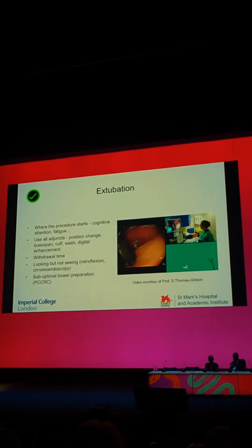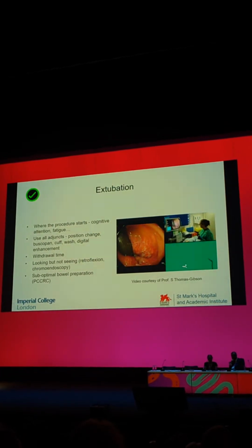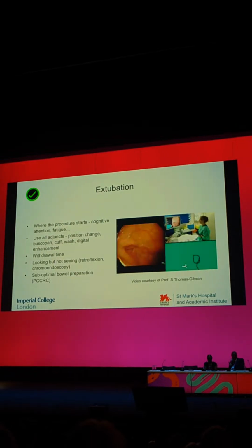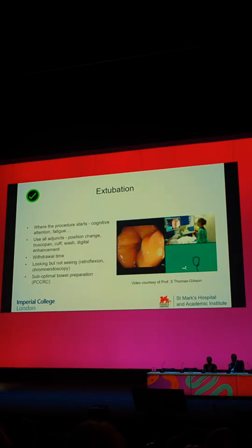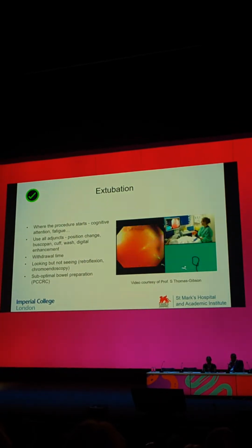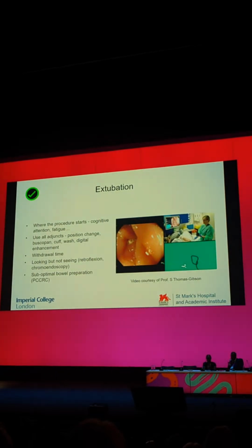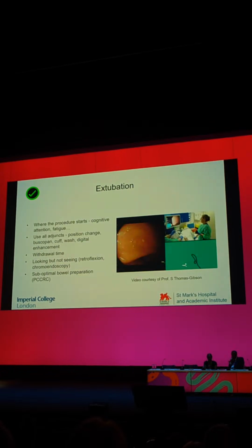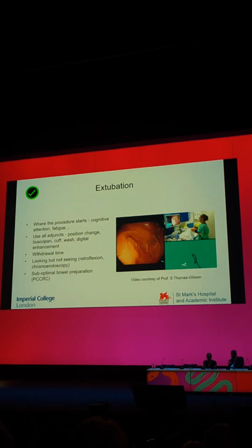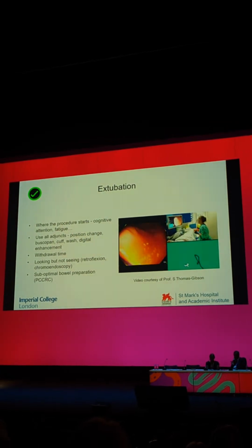And a tolerance for poor bowel prep will lead on to suboptimal bowel preparation, and we know that links to PCCRC. And you can see here on the video that we now get to the cecum, and the views aren't very good, but you can see very well that position change, particularly on the back, but also the right lateral, really just helps optimise your view here. So think about what you do in the time for withdrawal to make sure you give that patient the best chance to detect the pathology you're looking for.